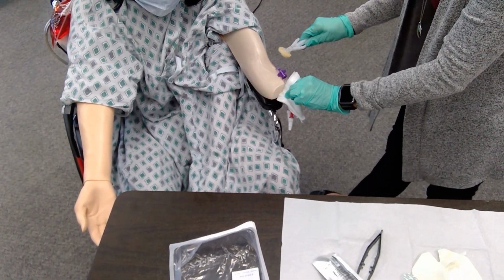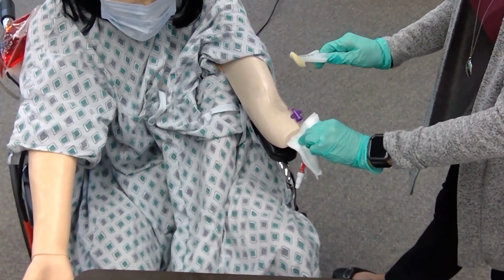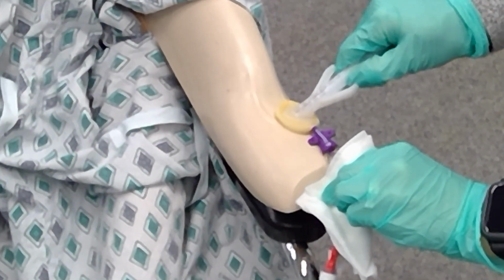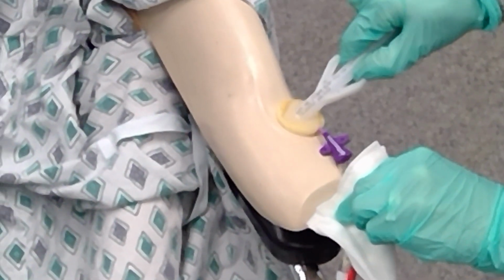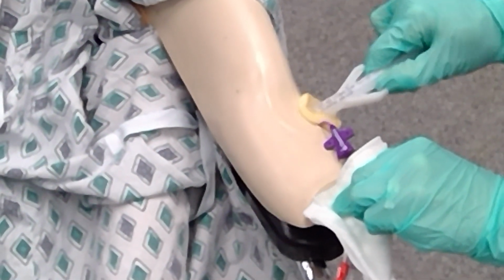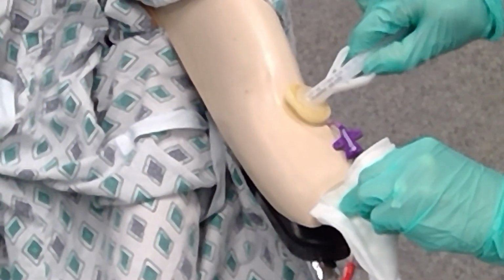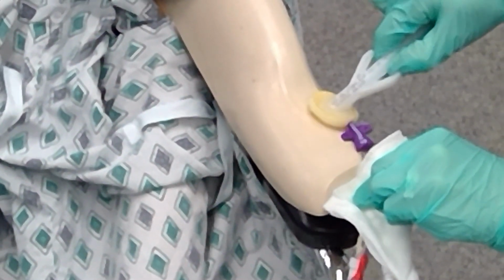Now, the goal is to clean the insertion site. Some students clean around the insertion site and never really get the insertion site good. So I'm going to start with the insertion site. I'm going to clean the insertion site vigorously up and down and back and forth for a good 30 seconds. I can get underneath the line. Just look at that insertion site and make sure you're cleaning that good, because that's the portal of entry into the patient. That's the break in the skin.